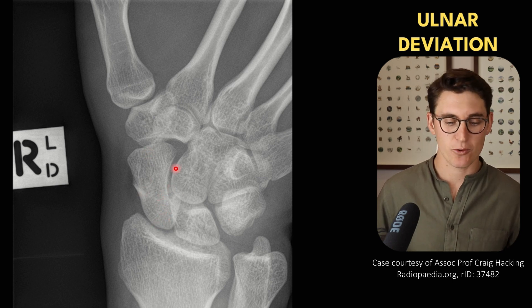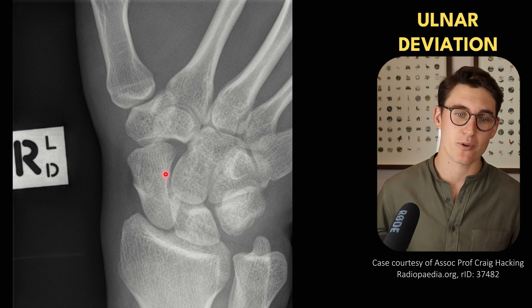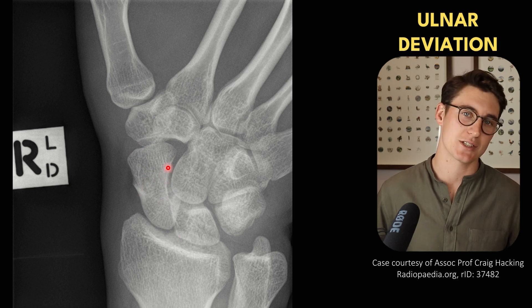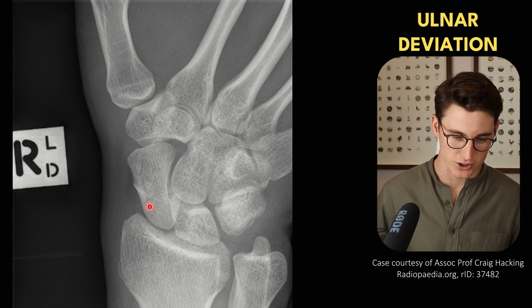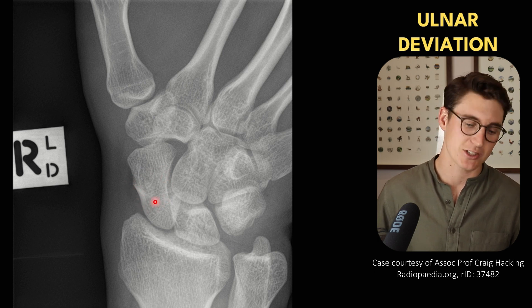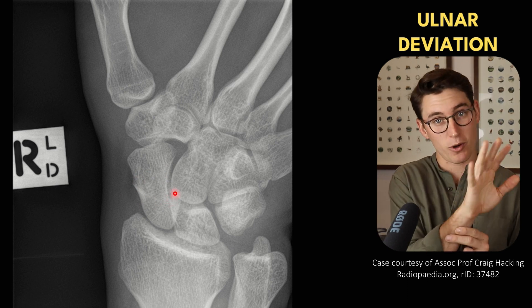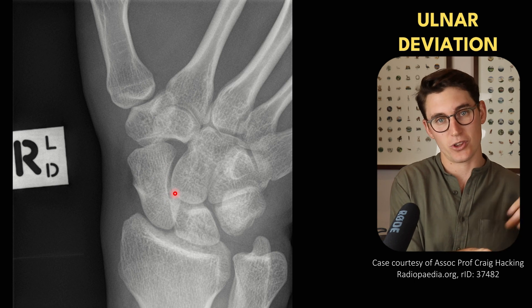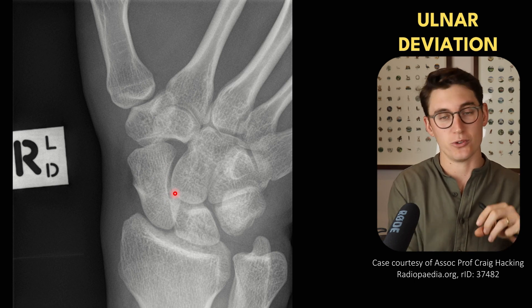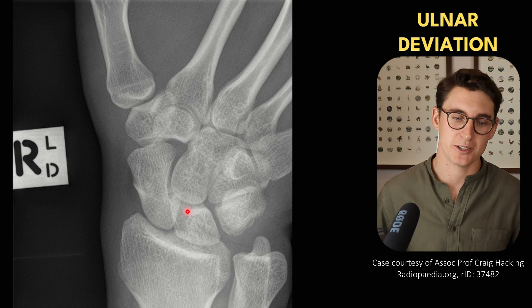The scaphoid has a distal pole and a proximal pole separated by what's known as the waist of the scaphoid. This is our most common site for fractures in an adult, so it's really important to see the integrity of the cortex around that portion. If pain doesn't allow a patient to perform ulnar deviation, we can take an angled view — a 30-degree angle view at the scaphoid — to give us that end-on look.